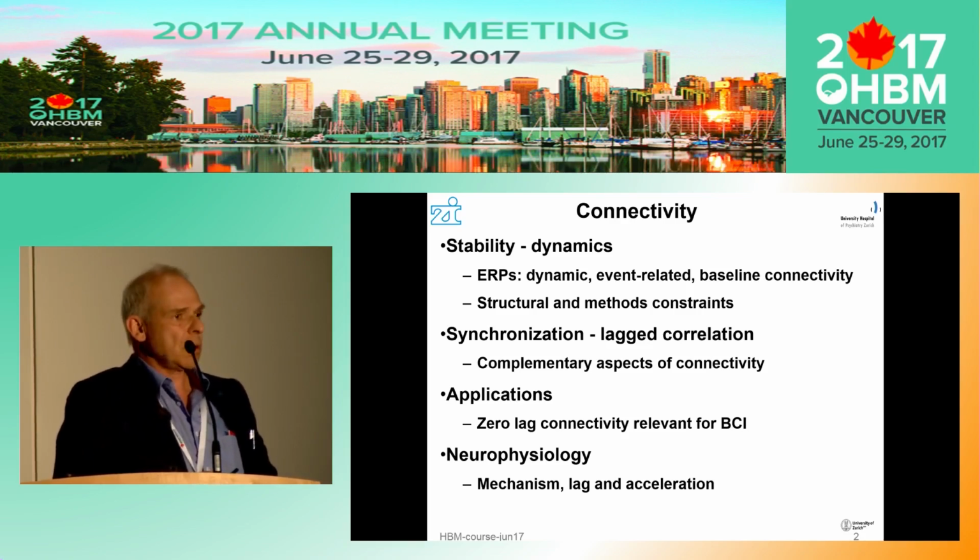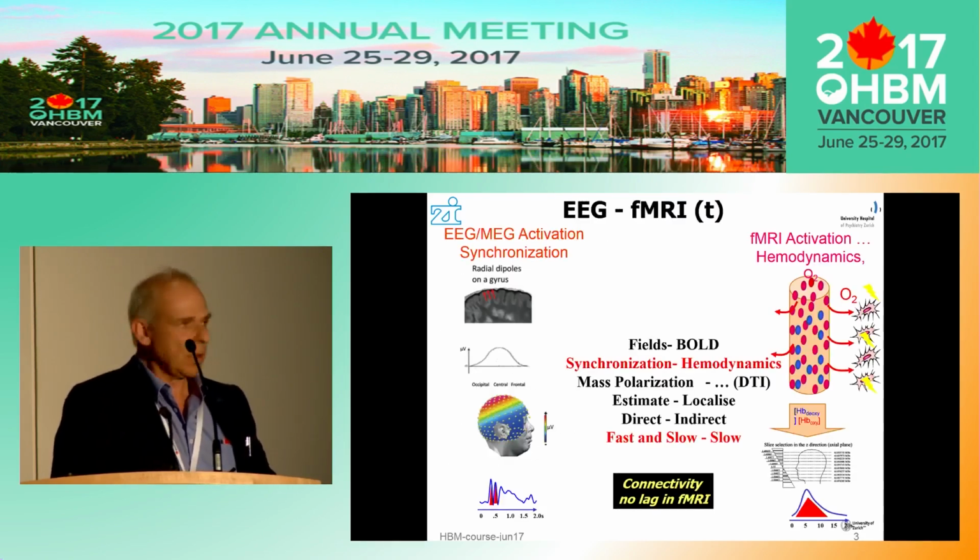And then there is also the aspect to consider: what is synchronization or non-lagged connectivity telling us about neurophysiology? Is there a neurophysiological explanation for that, or is it just volume conduction?